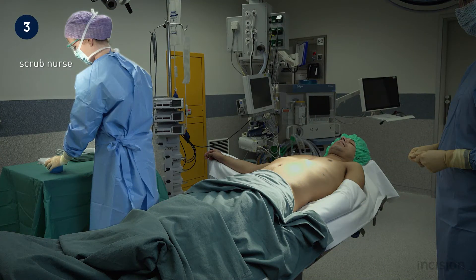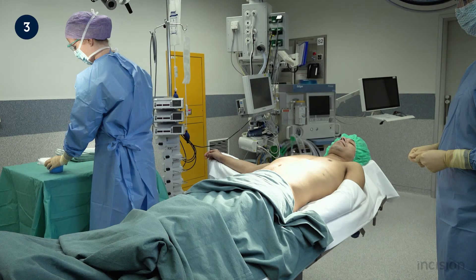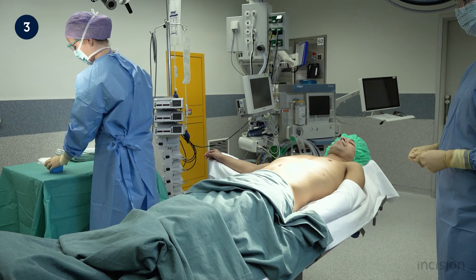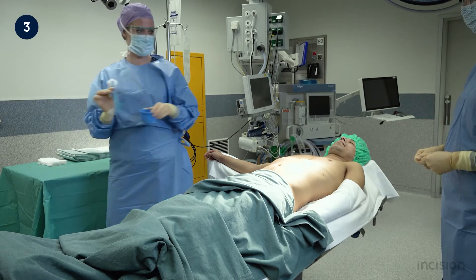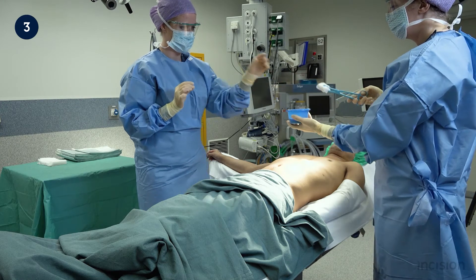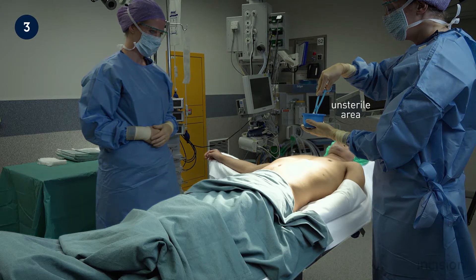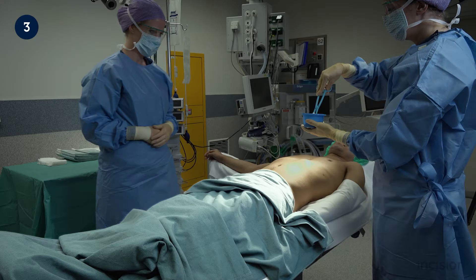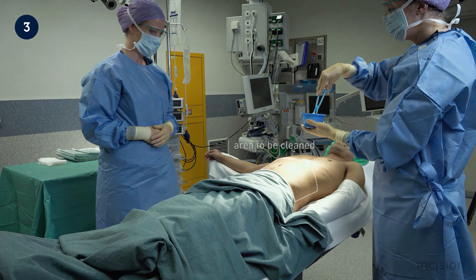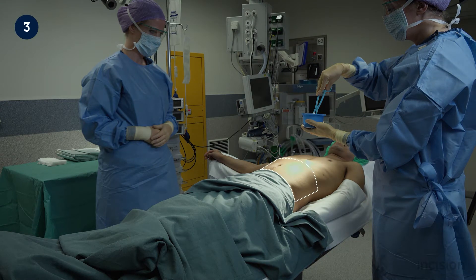Take note of the scrub nurse and the surgeon. This distinction is made purely to help describe the actions. The principles of disinfection and draping will first be demonstrated on the abdomen. Having prepared the cleaning solution and clamp as previously demonstrated, the scrub nurse passes both to the surgeon. Take note that both the patient and the surgical table are not sterile. The parts of the body not involved in the procedure remain covered to keep the patient warm and maintain their dignity. The exposed area to be cleaned should first be inspected for abnormalities, such as broken skin.